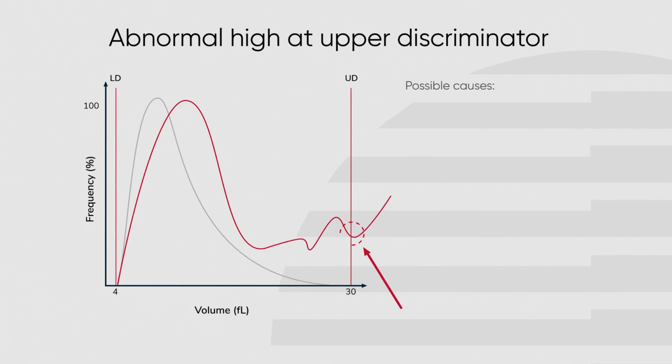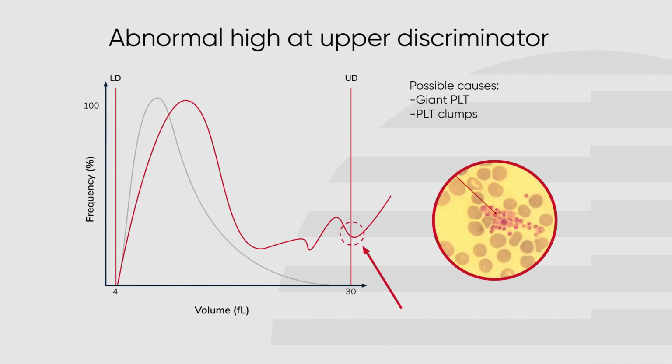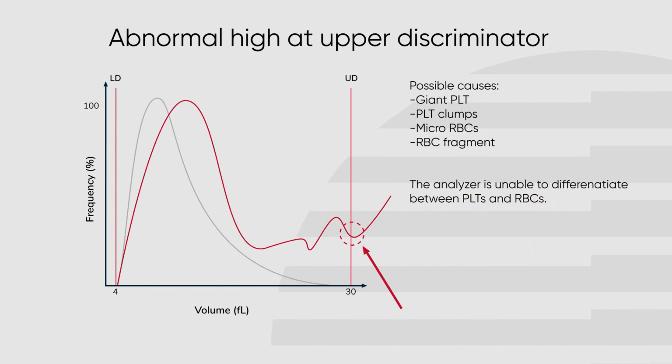An abnormal high at the upper discriminator could have several possible causes such as giant platelets, platelet aggregates, microcytic red blood cells, or red blood cell fragments. The reason for the abnormal high at the upper discriminator is that the analyzer is unable to differentiate in between these cells and complexes as they are very similar in size and the populations therefore merge. If this occurs, the instrument may flag for abnormalities in PLCC, PLCR, and PDW. Verify findings in smear.